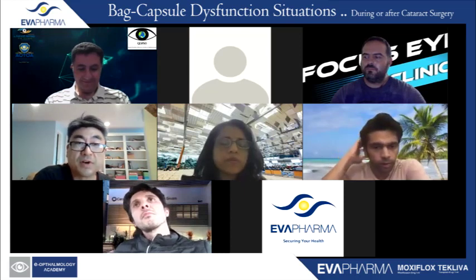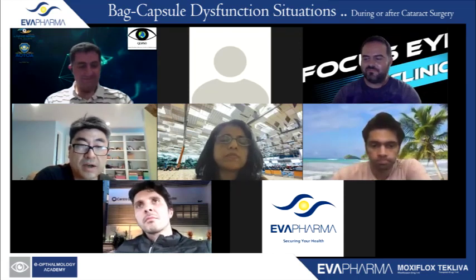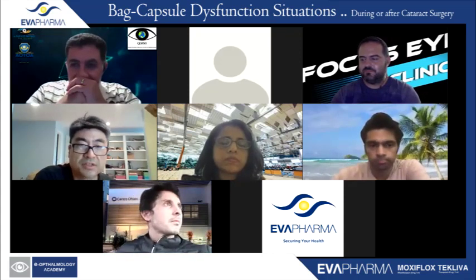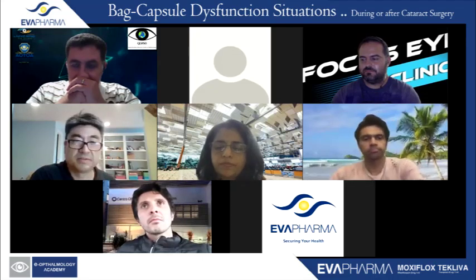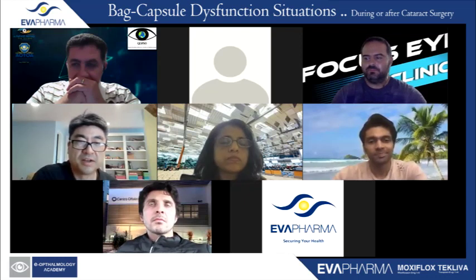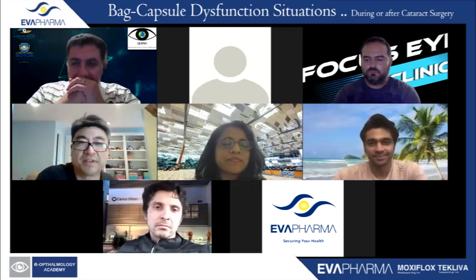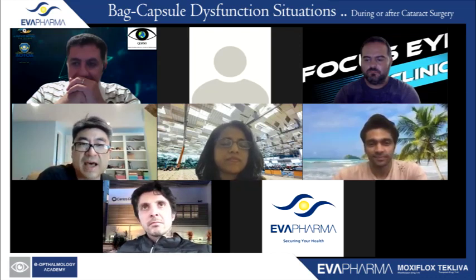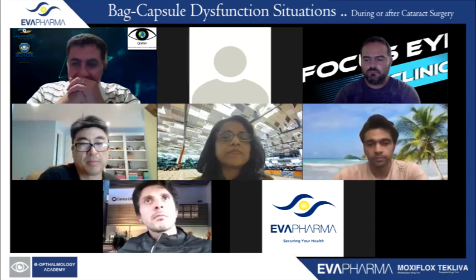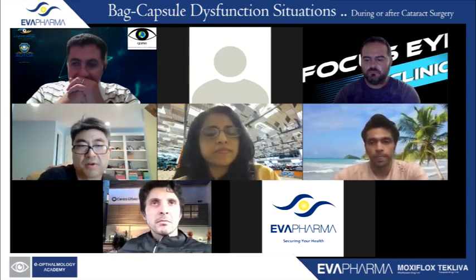No, once I've gone to this transition to this technique, honestly, the hard part for me with the surgery is no longer this part. It's about how do I get this dislocated lens with the giant Sommerings ring and it's dangling in the vitreous. I have to get this thing out of the eye. So to me, that now is really the bigger challenge. And so that does make me feel more confident that I don't really get too anxious about this part of the surgery anymore.